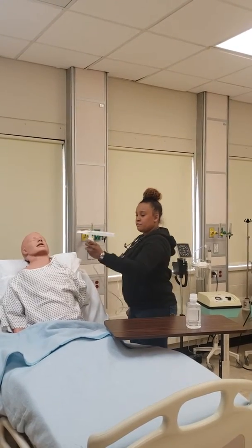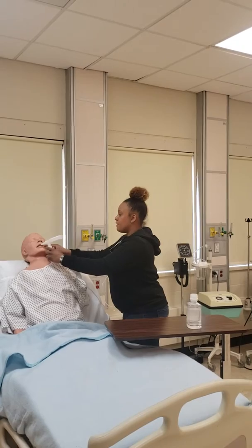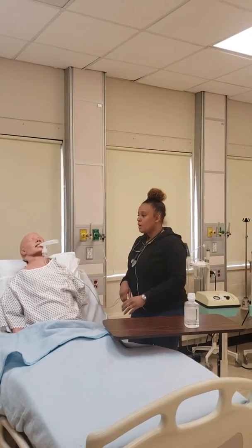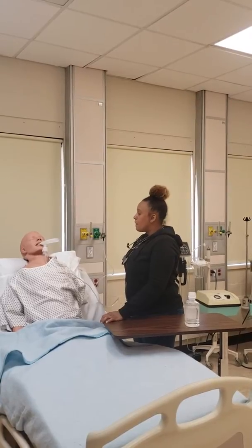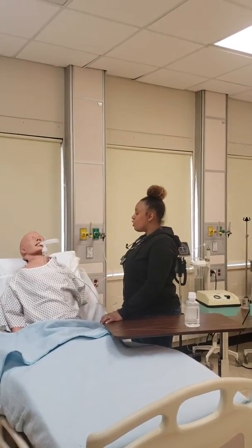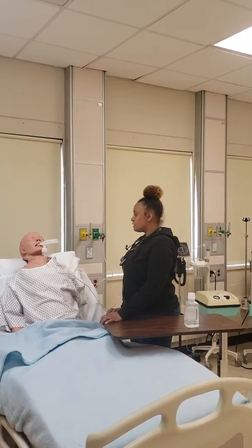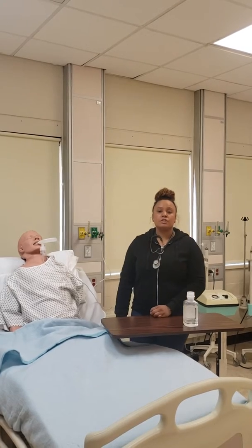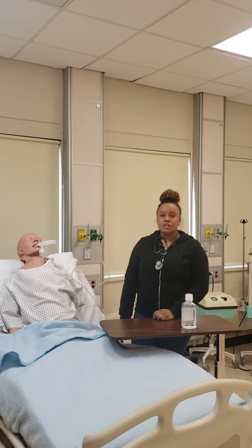I will now ask the patient, may you please hold your mouthpiece. Okay. May you please breathe normally. Taking a nice deep breath. Hold it for 2 to 3 seconds. Now exhale. At this time, I will remeasure the patient's pulse, respiration, saturations.